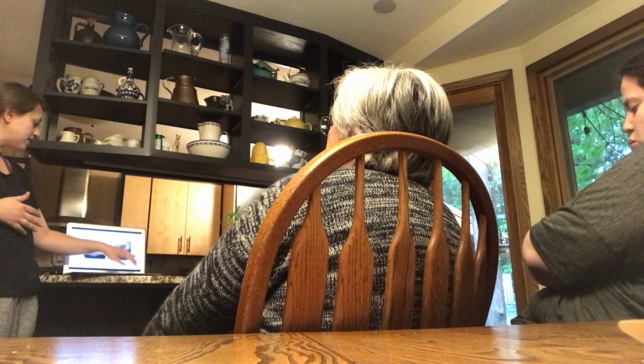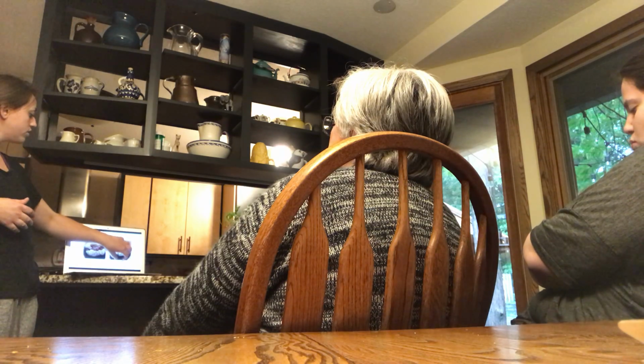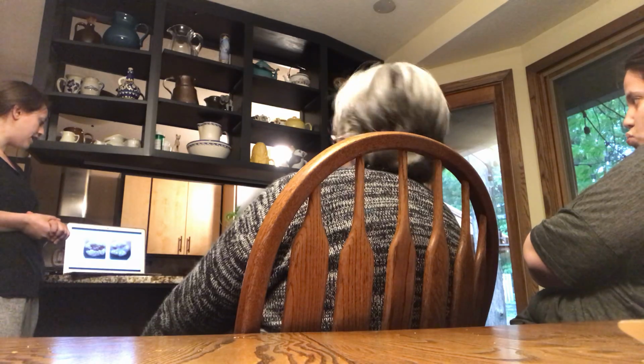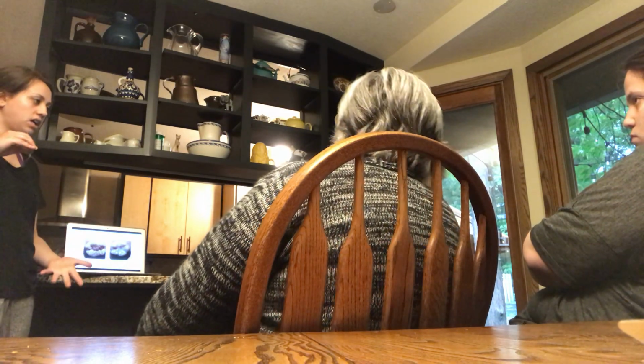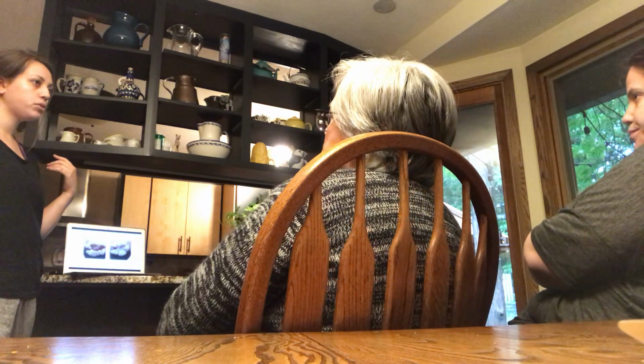And it should look like this afterwards, so you can see that all the chalky white areas back here were turned into areas covered by a sealant, glossed over. And that just helps make sure that the area there is going to be sealed off and protected from any bacteria.